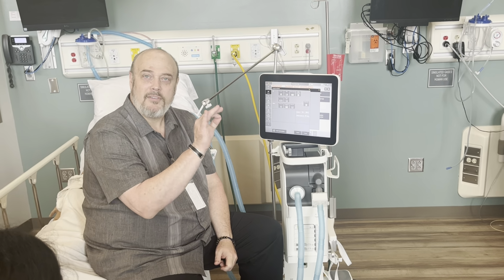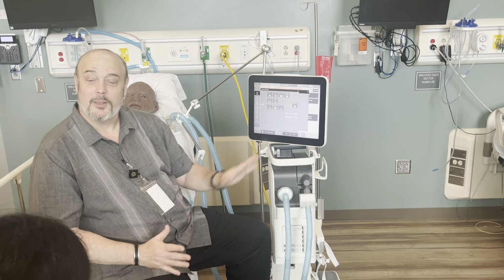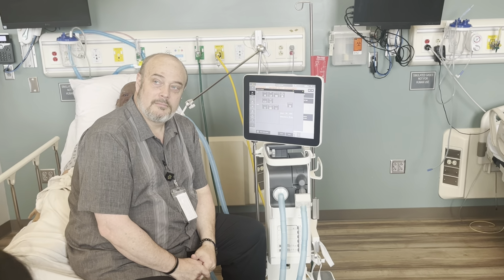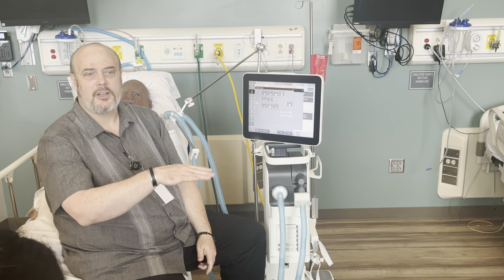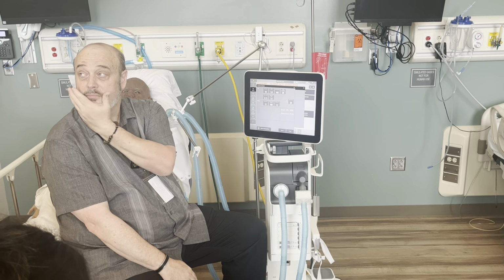So exactly, AVAPS on the machine, which is what I'm getting ready to say, is the exact same thing over here, except it's called volume support. So I set it on 400, and it jumps according to the pressure support, just like you would in AVAPS. There's no difference. It's the exact same thing.